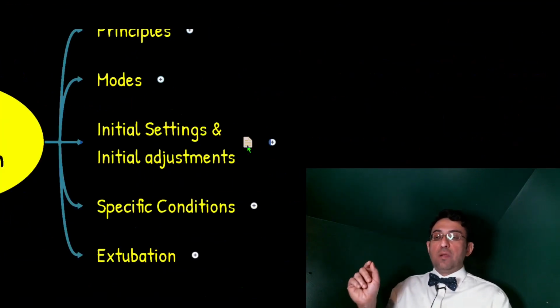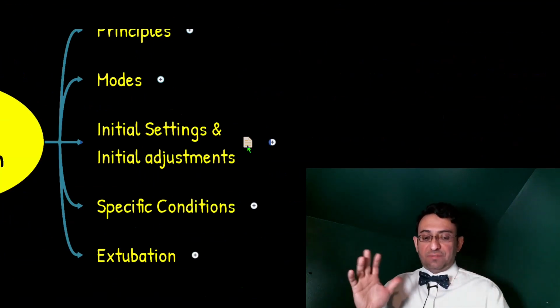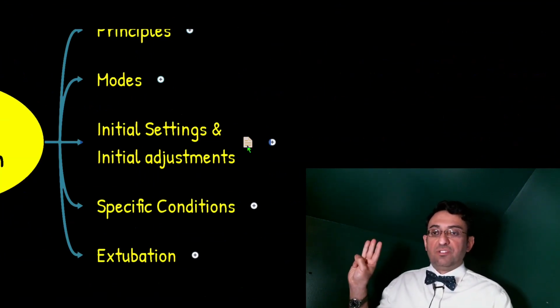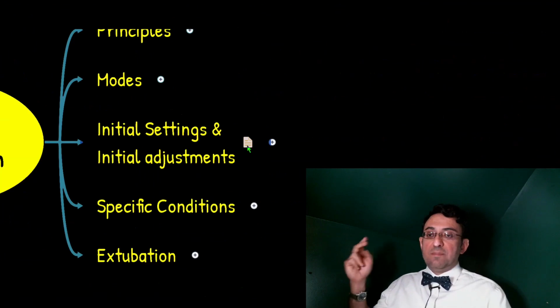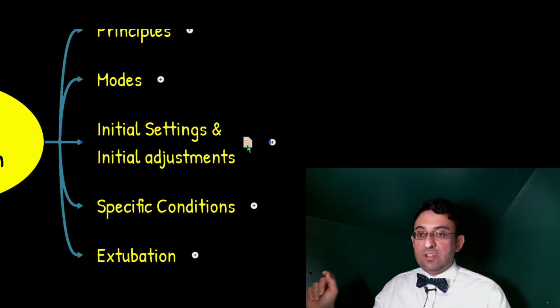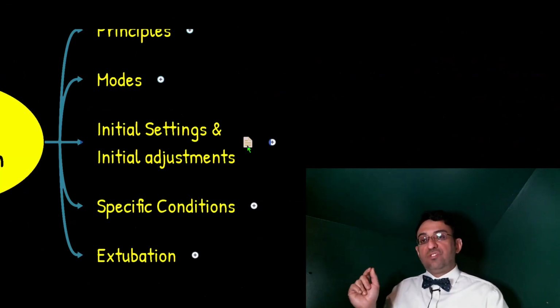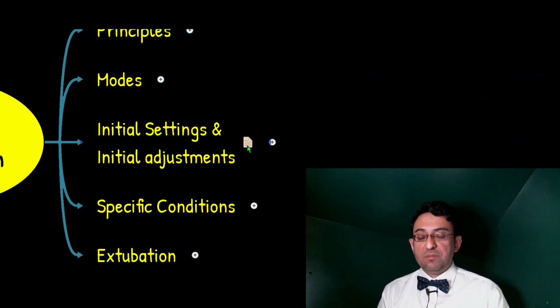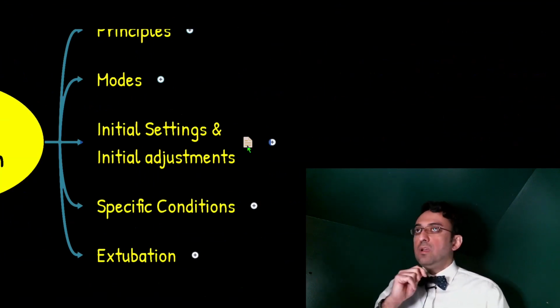Now, a very high yield subject is initial settings for mechanical ventilation. If you do not have time to memorize this brief summary or details, just remember three things. We initiate with high FiO2 and then gradually decrease it in parallel with adjusting PEEP. It means we initiate with low PEEP and then we gradually increase PEEP. Why this is a strategy in hypoxic failure? Because this helps prevent oxygen toxicity. Remember, the patients should not receive high FiO2 for a long period of time. So we mainly depend on PEEP or recruitment for the oxygenation.